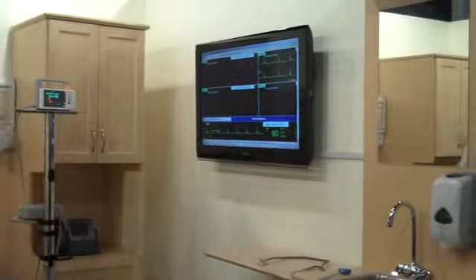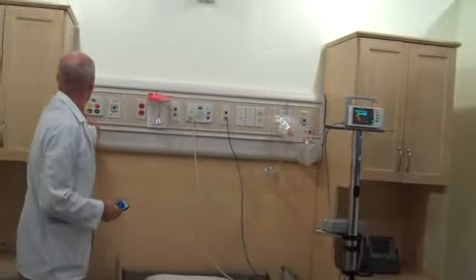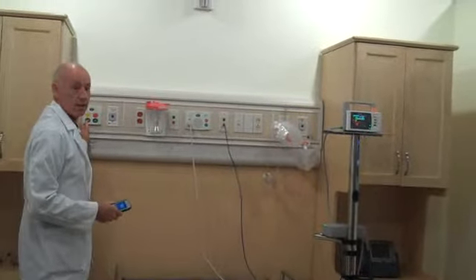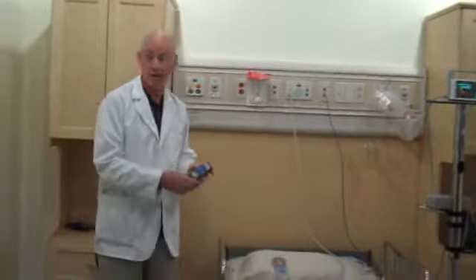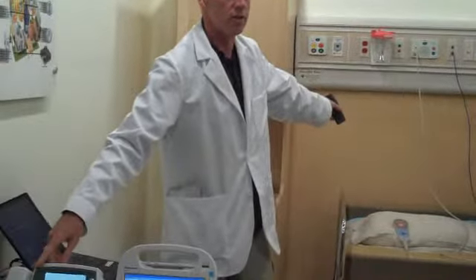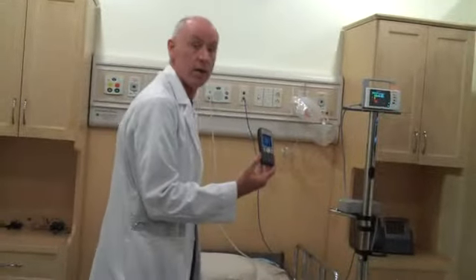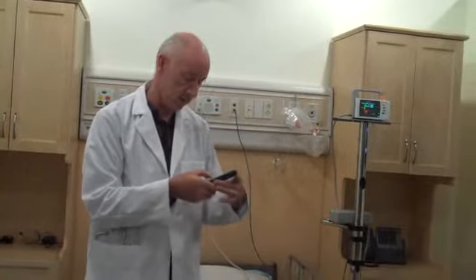Another quick example. Let's say the patient got better and now the bed needs to be cleaned. This time I'm going to press the cleaning needed button. Now this time you have to pretend I'm not a nurse, but now I'm the maintenance staff, the janitor, right? So when I press cleaning needed, the phone call doesn't go to the central station. It just goes directly to the maintenance staff phone that says someone has to come here and clean the room and make up the bed. And it's just an XML message there that says the room number and cleaning's needed.